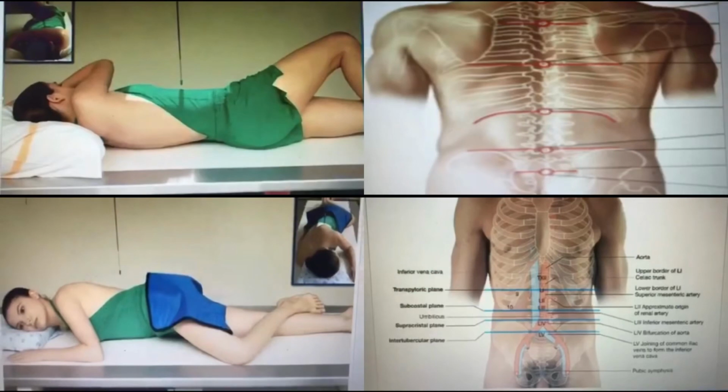So that's all for today. That is the central ray of different body habitus for upper GI series.